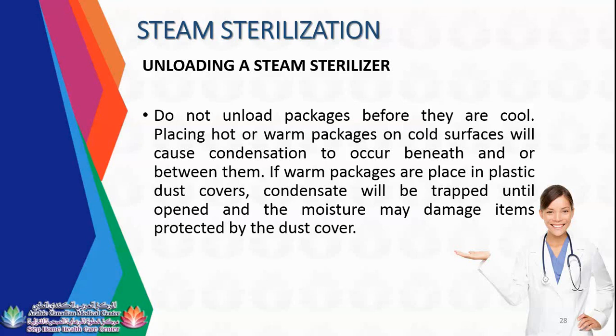If warm packages are placed in a plastic dust cover, condensate will be trapped until opened, and the moisture may damage items protected by the dust cover. If the packaging is still warm and you put a plastic covering on it, it can create puddles of water, and it can generate steam on the instruments.